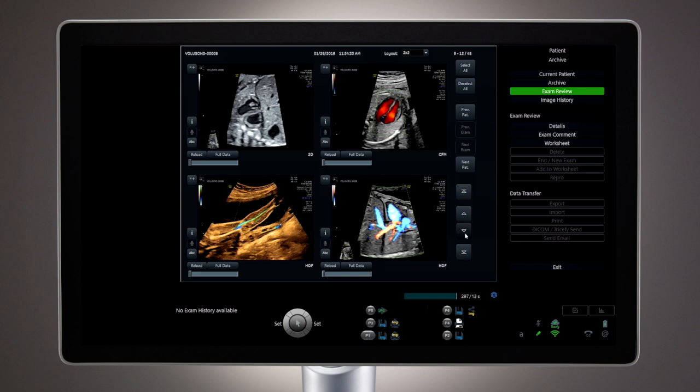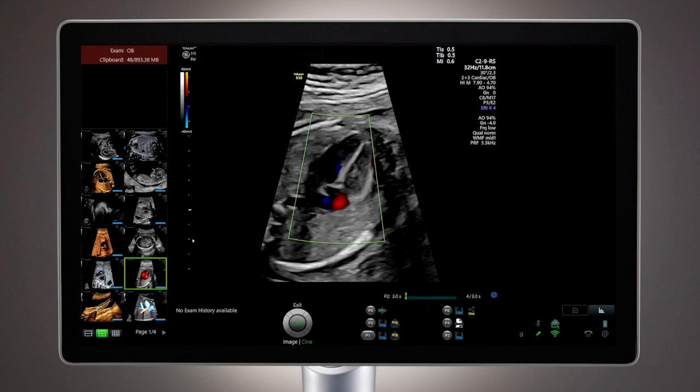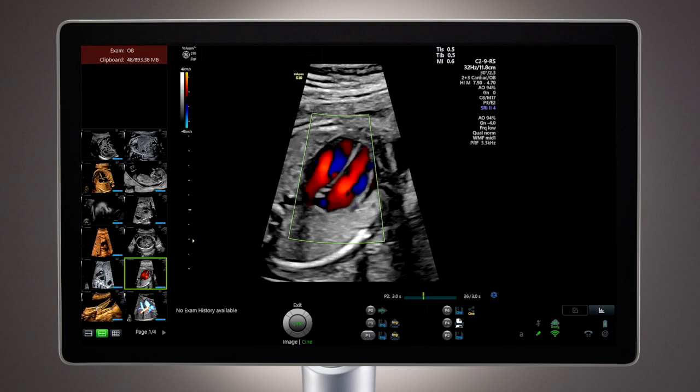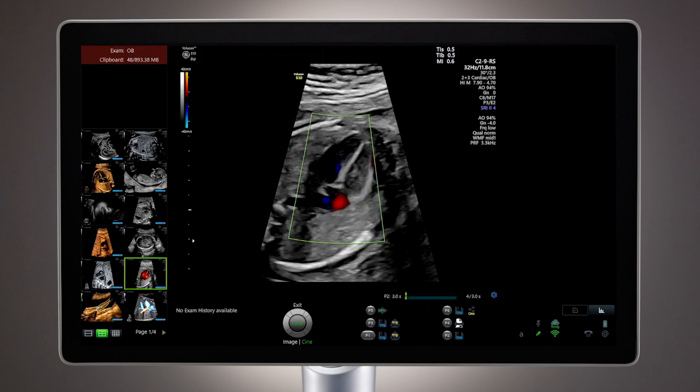When a particular image is identified for further evaluation, simply click Reload and this image will be displayed in full screen.